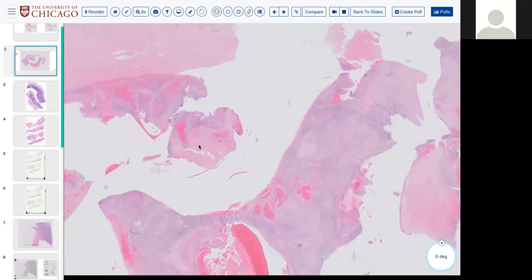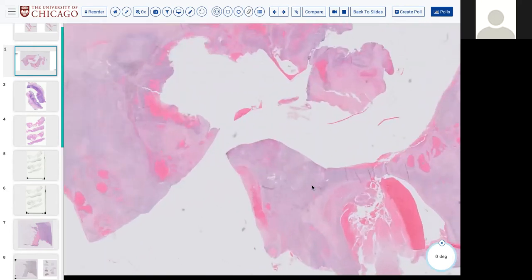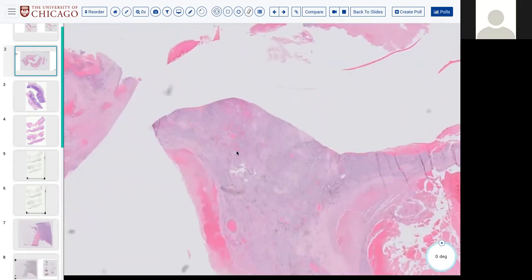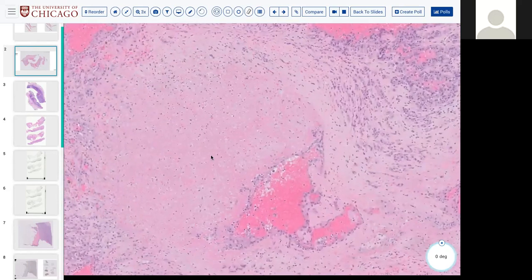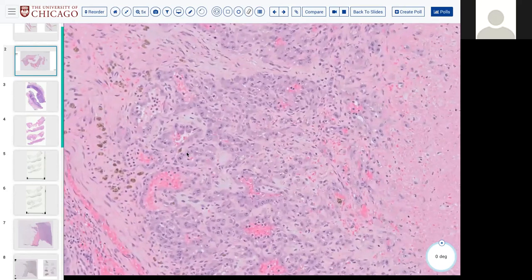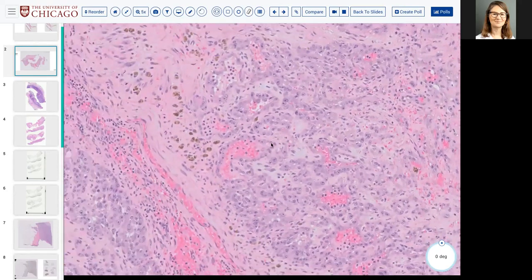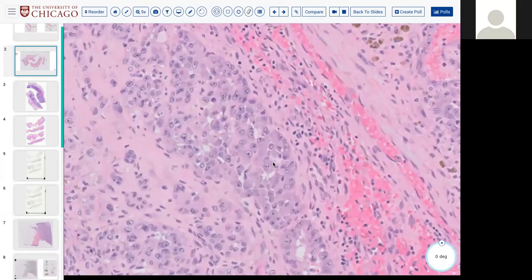So the majority of the tumor is kind of solid sheets. We have irregular vascular channels. We have focal infiltrative patterns. The cells are plump, polygonal. Cytoplasm is eosinophilic. The nuclear atypia is, I could say, moderate, but it's easy to recognize mitotic figures.